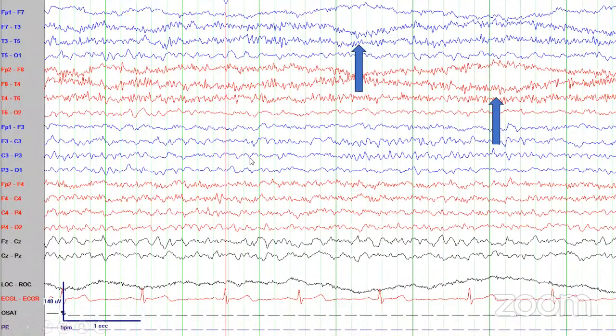In this slow roving eye movement, we have a phase where the two waves are far apart, and we have a time when the two waves are opposed to each other. What we see is that opposing together on one side is moving away on the other side. So the wave which is apart is the side to which the eye has moved.